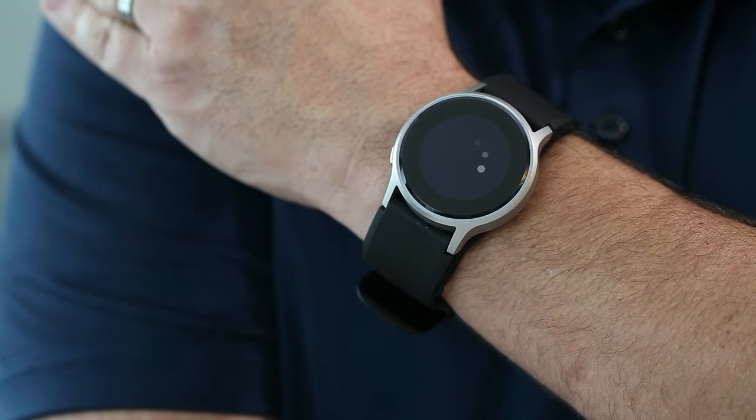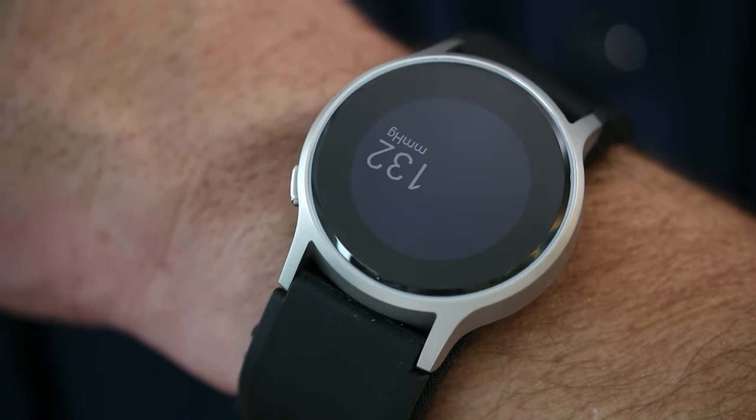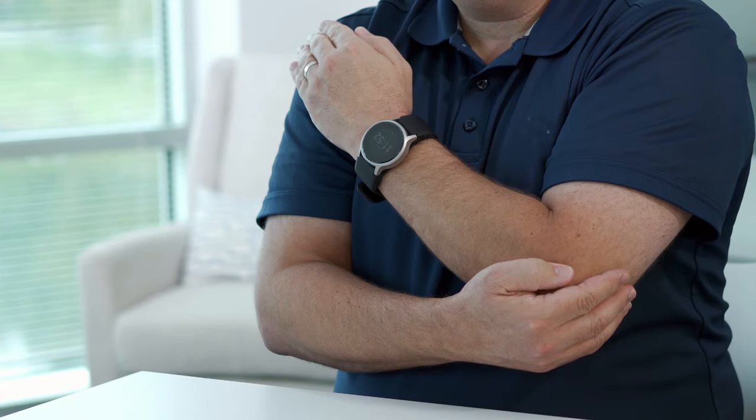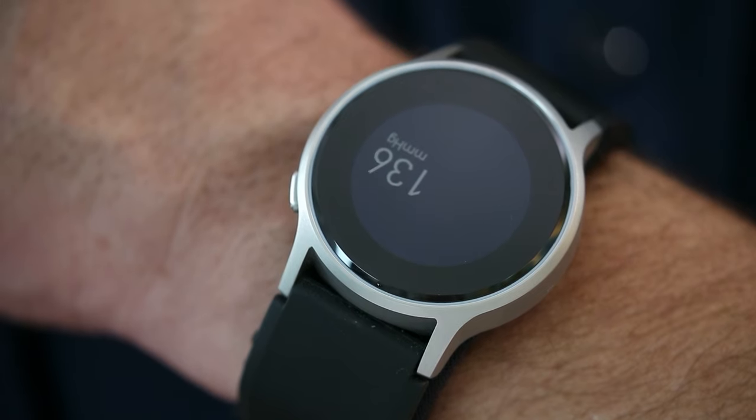After approximately two seconds, the monitor will start a measurement and the cuff will inflate. During this process, it's important to keep the watch still. Do not move, turn your wrist, talk, or look at the watch display while the cuff is inflating, as it may affect your results.